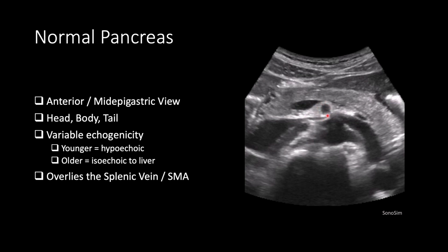I'm going to put on some color so that you can see each of these structures a little bit more readily. So now we have a colorized version of this organ, and we can see the pancreatic head here in purple, the body is yellow, and the tail is this teal color. And I went ahead and highlighted the SMA, which looks sort of like a rising sun, a nice clear structure surrounded by a little fat pad that makes it really unique and pretty easy to find once you get an adequate view.